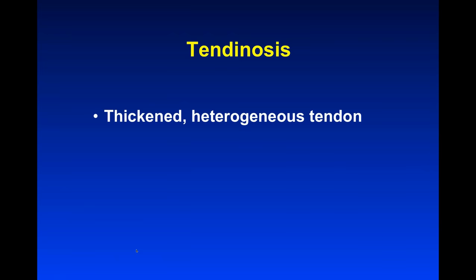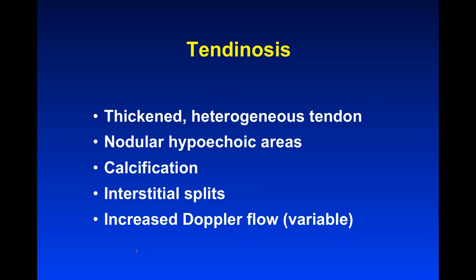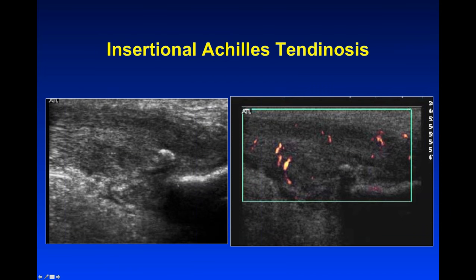On ultrasound, because of those pathologic changes, the tendon will thicken due to scar tissue and mucoid degeneration, and become heterogeneous. You may see nodular hypoechoic areas corresponding to the degenerated areas. Calcifications can occur and look bright. Interstitial splitting and increased Doppler flow are variable but common findings. Here is an insertional Achilles tendinosis — right where the Achilles comes down to the bone, it's very thick and very heterogeneous. The fibers are still there but separated by degenerated material. There's a calcification, a partial tear, and random blood flow as well.